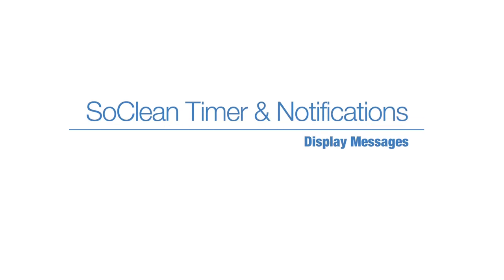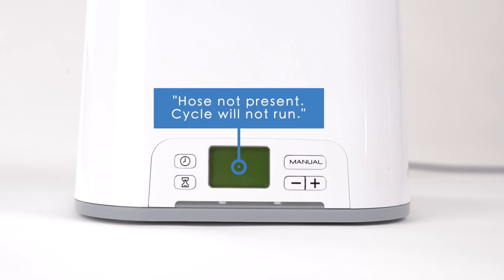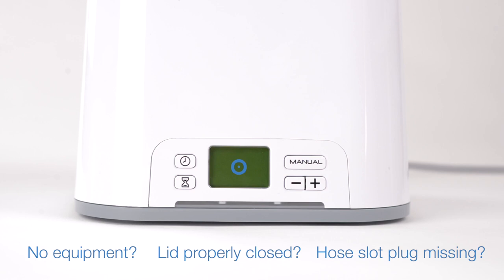Display messages: "Hose not present — cycle will not run." This message displays during manual mode when there is no equipment in the SoClean, the lid is not properly closed, or the hose slot plug is missing or improperly seated. If you've confirmed the equipment, lid, and hose slot plug are correctly in place and you still encounter this display message, please contact SoClean for support.